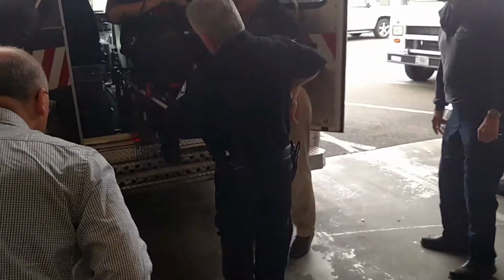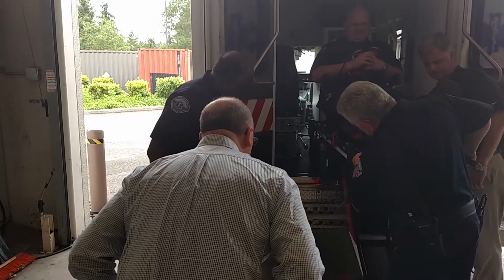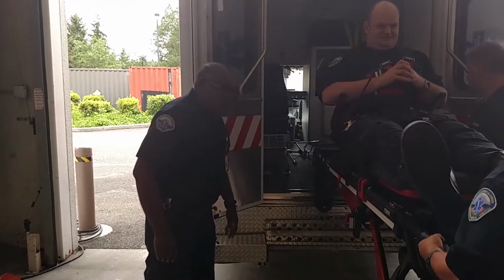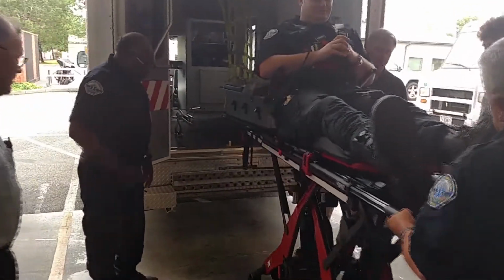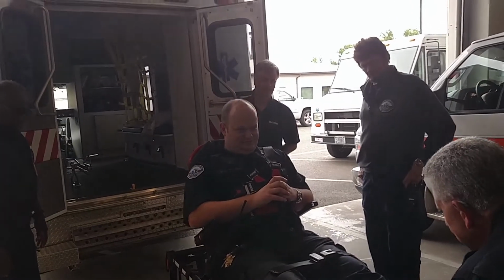There you go. Now push plus. Plus. And forward. There you go. Now pull out. You feeling anything right there? No, this is not you, I'm talking. Ta-da. Press and hold minus. Press and hold minus. There.